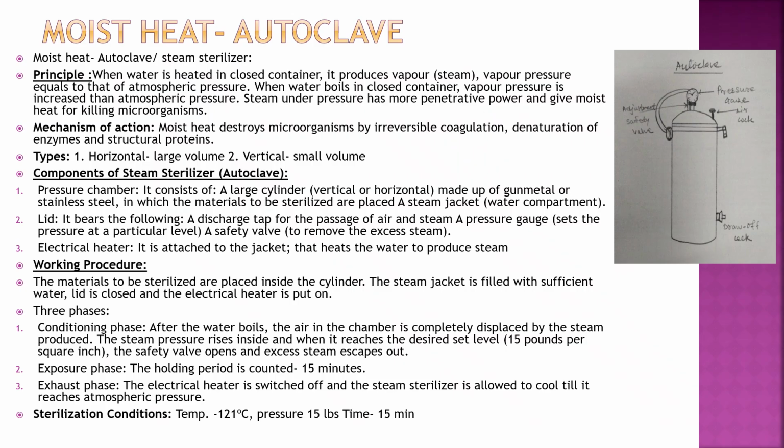Hello students, let's study moist heat. So in that we will see the autoclave in detail. It is also called a steam sterilizer.